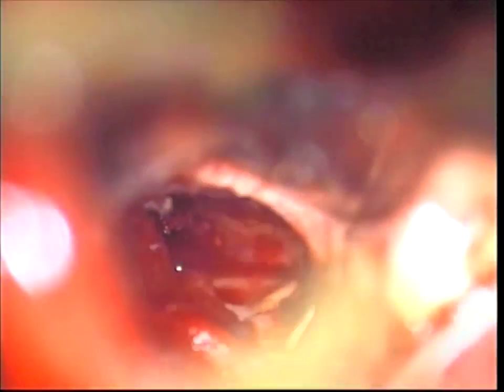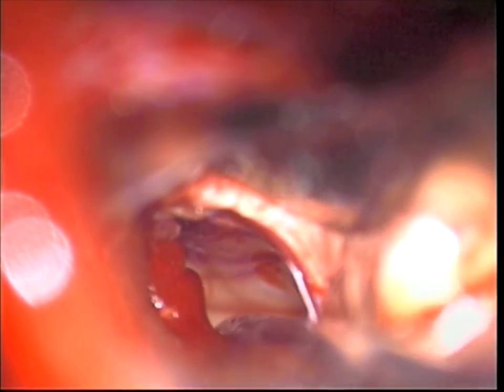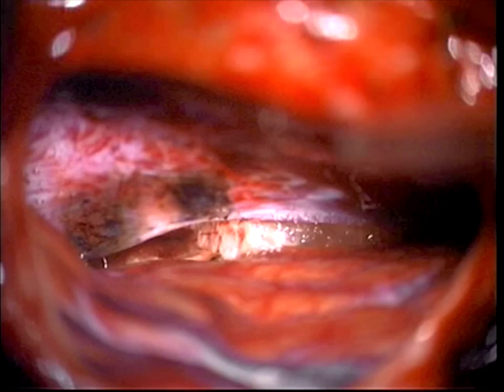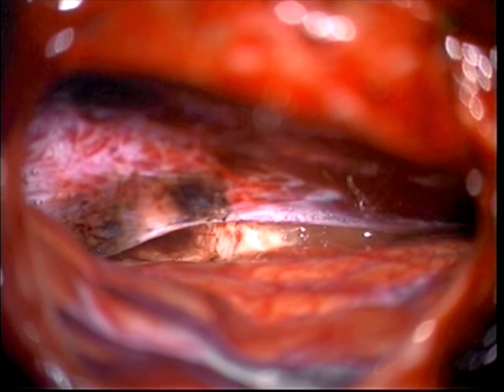You can see it looks pretty clean now, completely dissected off the other side. Looks pretty clean with good hemostasis. You can see the falx has been bipolared there on the edge. No retraction — brain looks very relaxed. One of the big advantages of these approaches is the patients don't have that much neck pain, and it's a little less traumatic in terms of that.